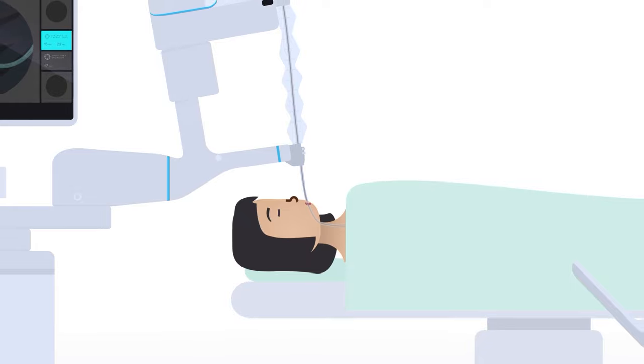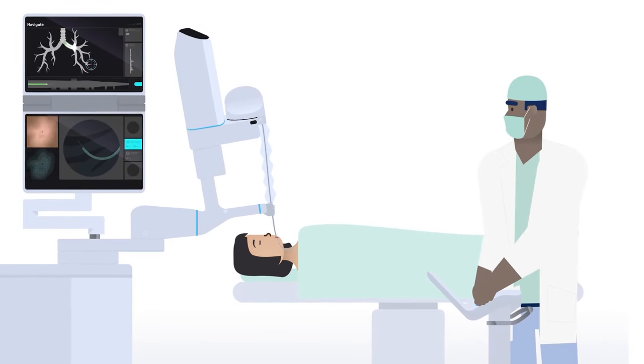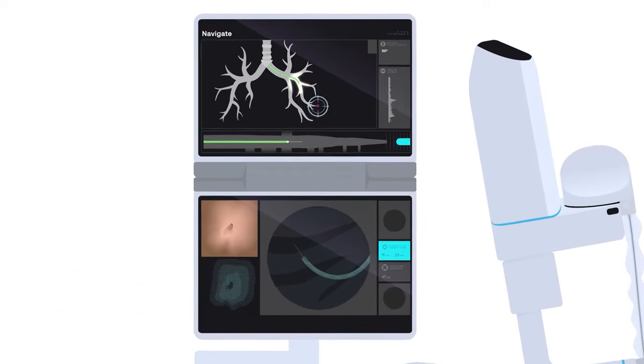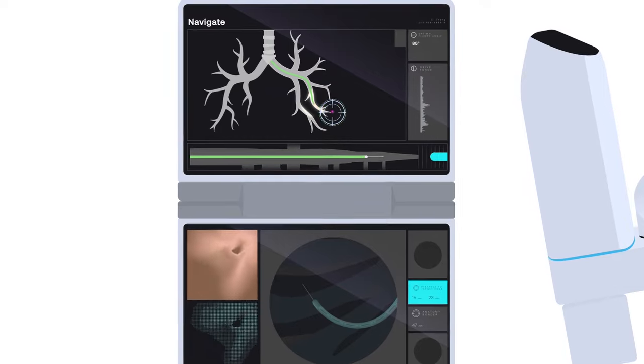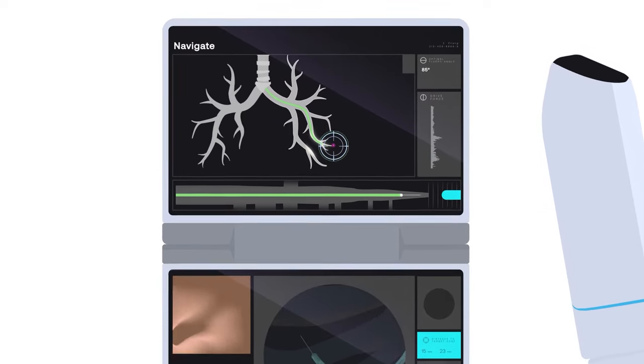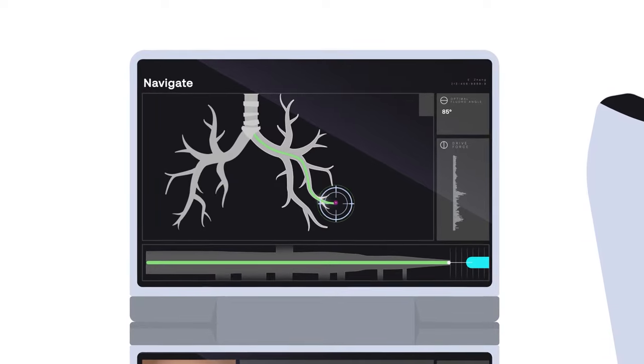The catheter is then steered by the physician under direct visualization, following a designated path that has been pre-mapped from a CT scan of the patient's anatomy leading directly to the target nodule, much like GPS in our cars.